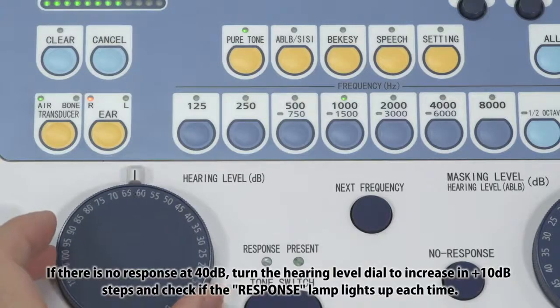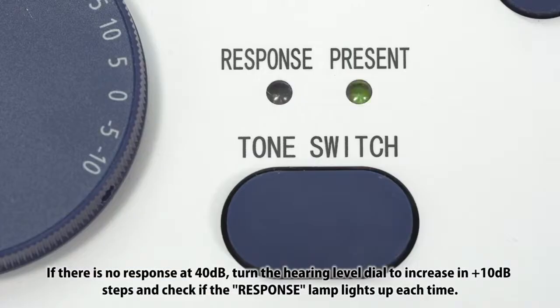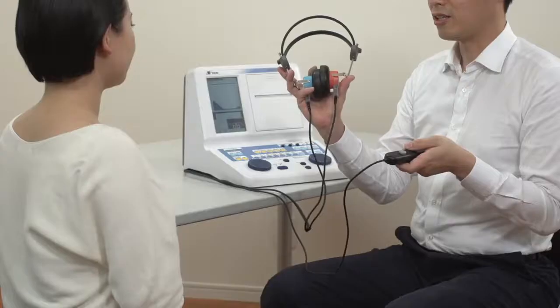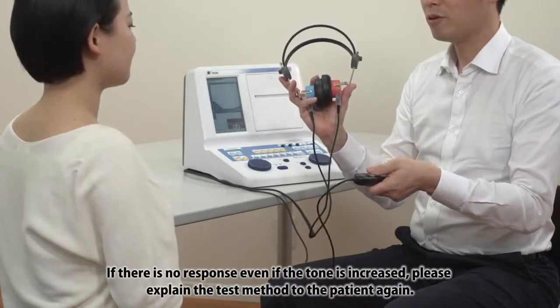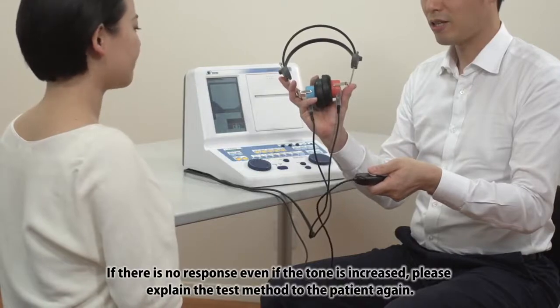If there is no response at 40 dB, turn the hearing level dial to increase in 10 dB steps and check if the response lamp lights up each time. If there is no response even if the tone is increased, please explain the test method to the patient again.